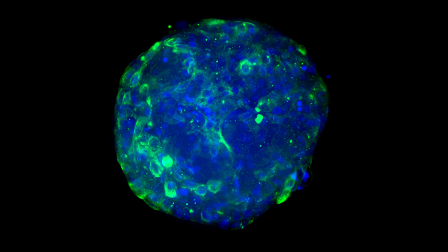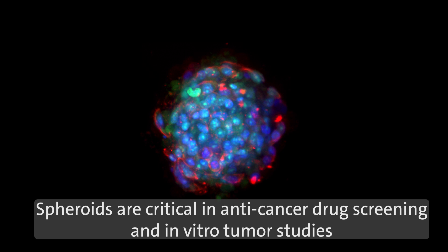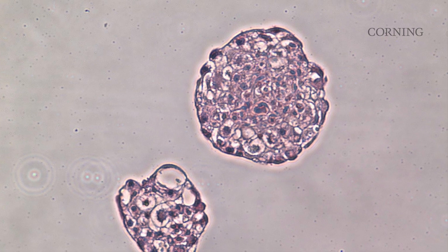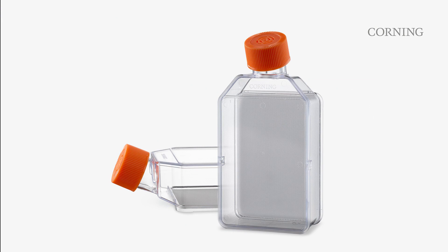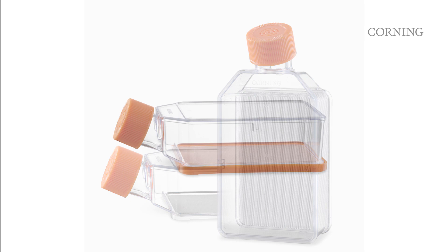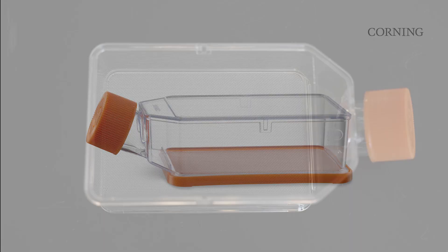Critical in drug screening and other applications such as cell therapy research, spheroids are coveted for their ability to more closely resemble the original tissue biology from which they were derived. 3D cultures are now being widely adopted, driving the need for more efficient methods to produce mass quantities of replicated, uniform-sized spheroids. The Corning LPlasia 12K flask addresses this need by enabling the straightforward generation of large quantities of uniform spheroids under scaffold-free conditions.